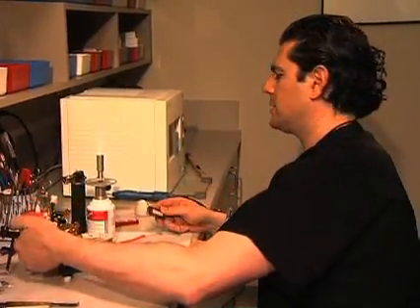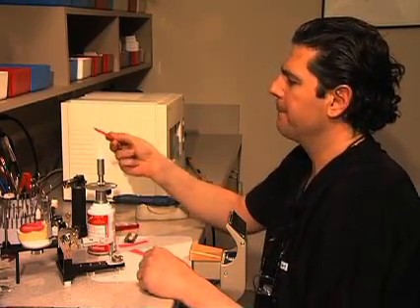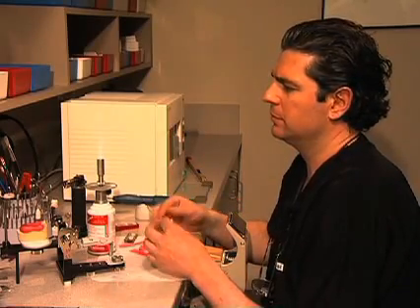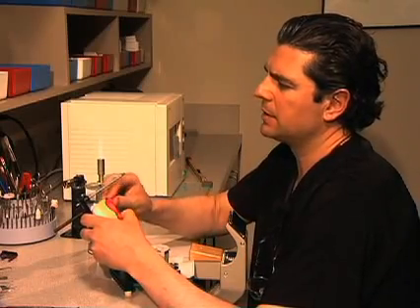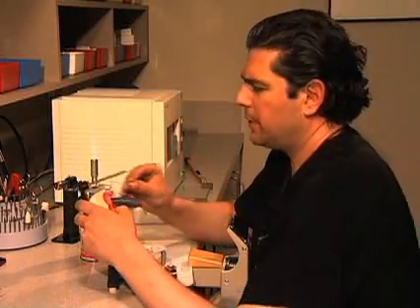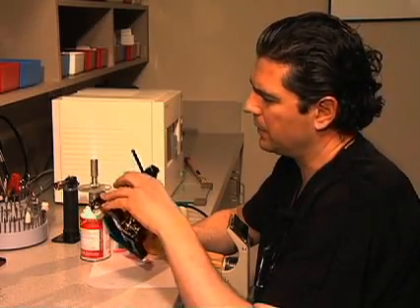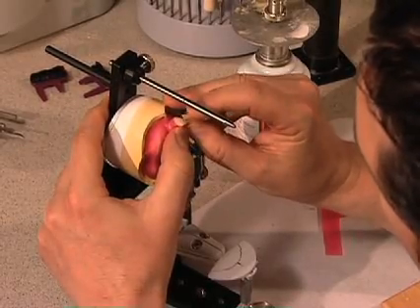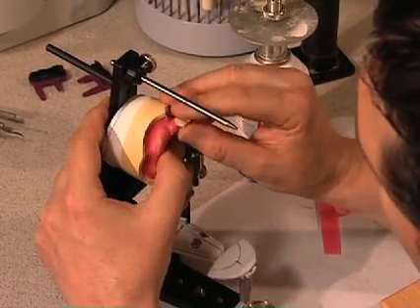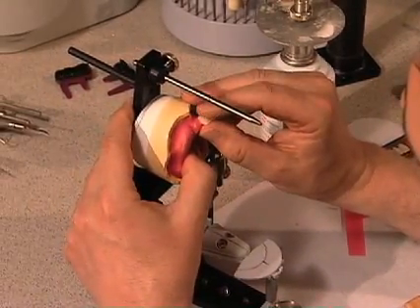We're going to start off with the maxillary central incisor — you can pick any one you like. We're going to start off with number nine. There are a couple of landmarks I'd like to share with you when setting up maxillary anterior teeth. By far, these are the most difficult teeth to set up and they take the most amount of time.